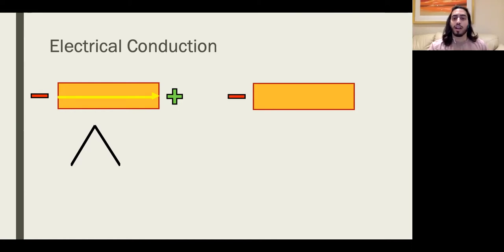So say we put another electrode down, that's a negative there, and we put another positive down. And this time the action potential is going away from the positive, okay? If you're going away from the positive, what will we expect? Just a negative deflection, okay? That is the ultimate basics of those lines that you're seeing on all of the ECGs, okay? So if you see a positive deflection, that means wherever you're looking at from the heart, that's where the action potential is going, okay? And then vice versa for the negative.